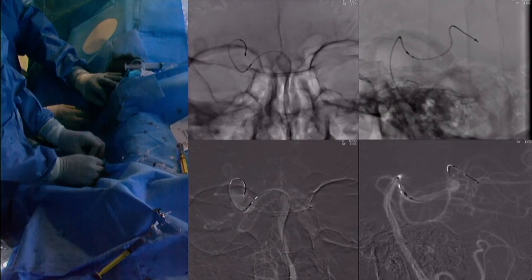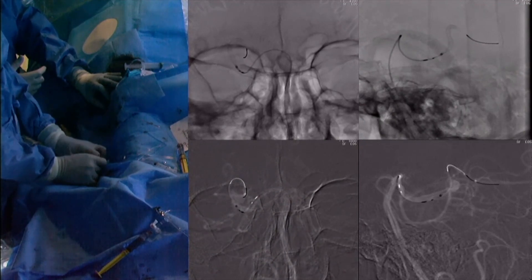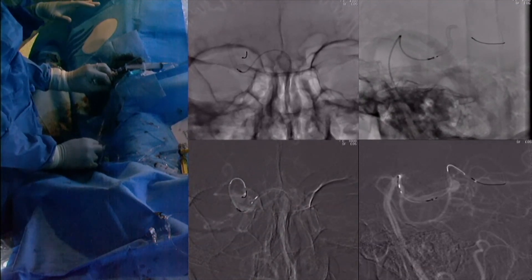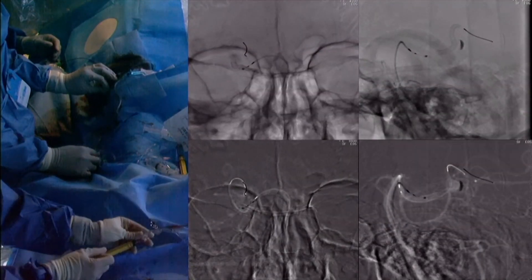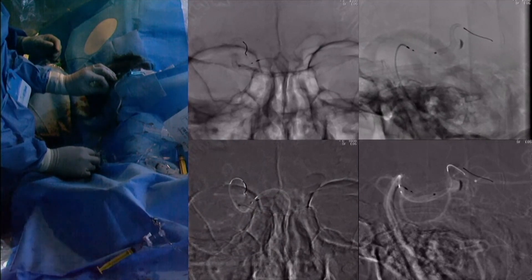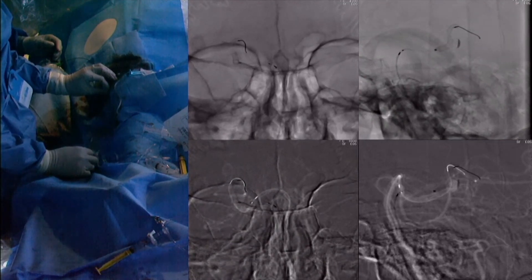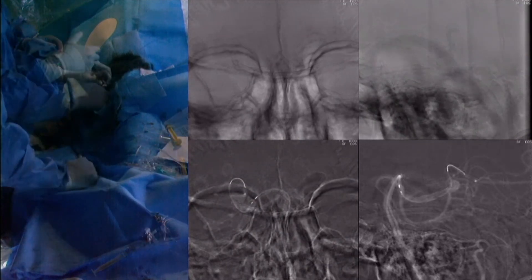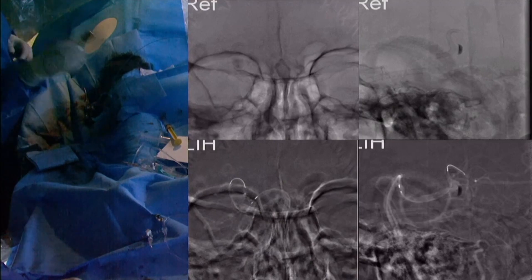Here we can see deployment of the stent distal, across, and proximal to the aneurysm. We now bump the stent proximally in order to compress the stent a little bit, to reduce the interstices and create more flow diversion. Here we can see a meniscus or stasis of contrast in the aneurysm. Once we are satisfied with the placement of the stent, we then retrieve the stent delivery wire as well as the microcatheter. Final angiograms show persistent stasis of contrast in the complex aneurysm with excellent flow in the parent vessel.